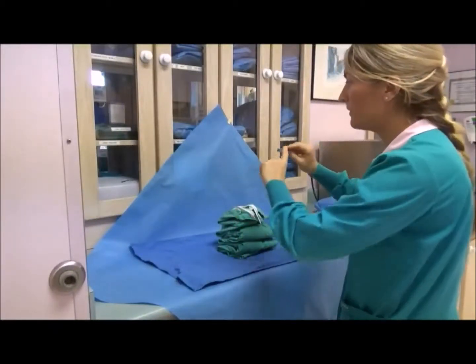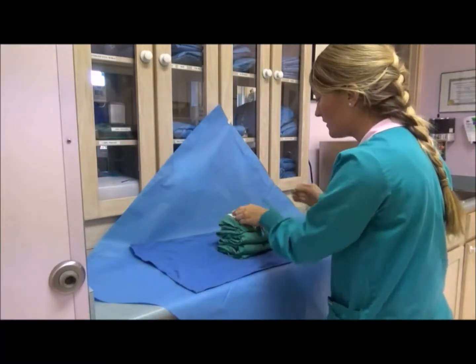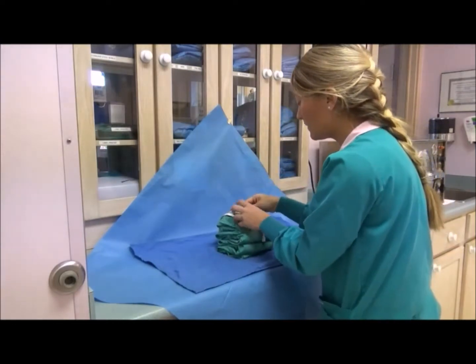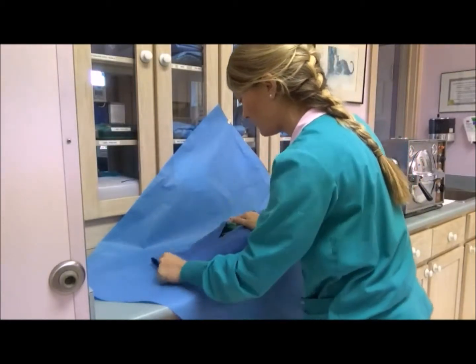I've already prepared the paper outer pack wrap. I placed a lint-free towel in the center and I placed my surgical drape in the middle. So I'll put a steam indicator strip right on top of the gown and I'll proceed to fold the towel in the appropriate manner.